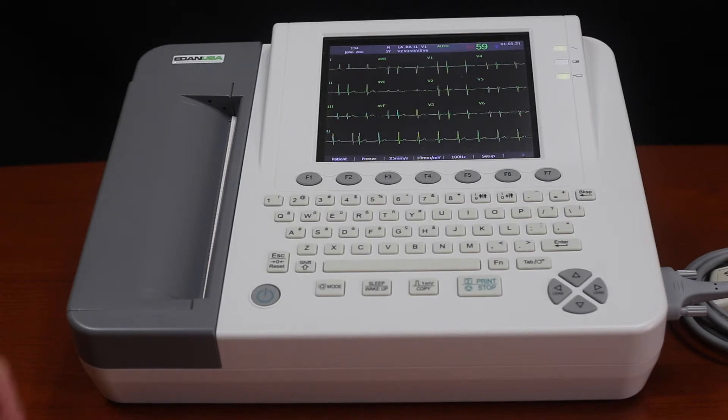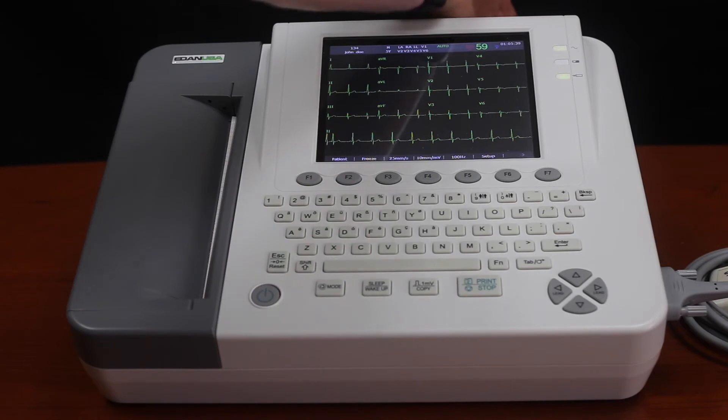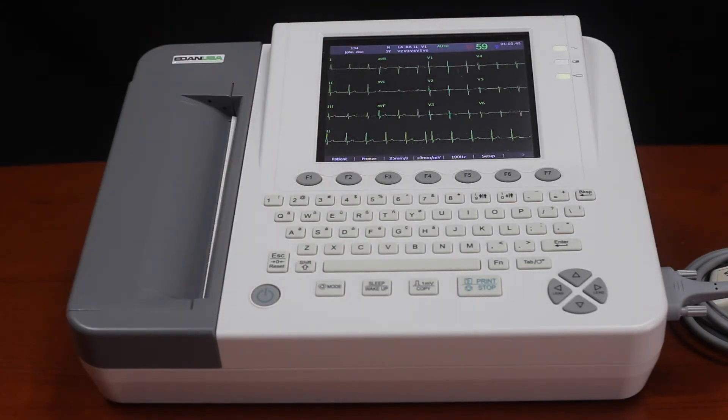It does have a built-in rechargeable battery that will last about four to six hours on a full charge. To recharge it, just plug it in using the included power cord and that'll recharge it — it doesn't take very long to get a full charge.